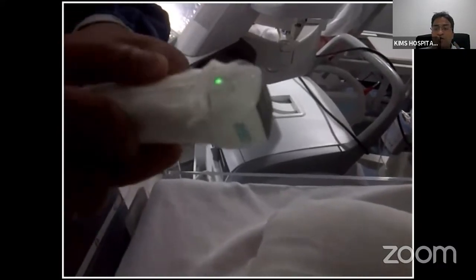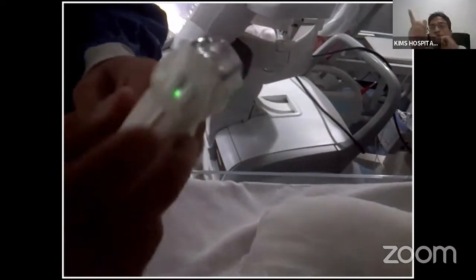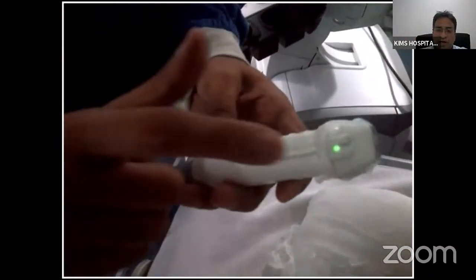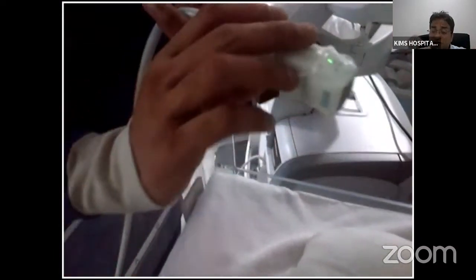This is the marker. You have to see the marker on the left side, and the screen marker also should be on the left side. And you should see the jelly. Why am I doing this with the hand? The jelly should be warm. Sometimes when we put cold jelly on a small baby, it will cause a startle and the baby will wake up. So you should not use cold jelly. As a protocol, we put warm jelly and then we proceed.